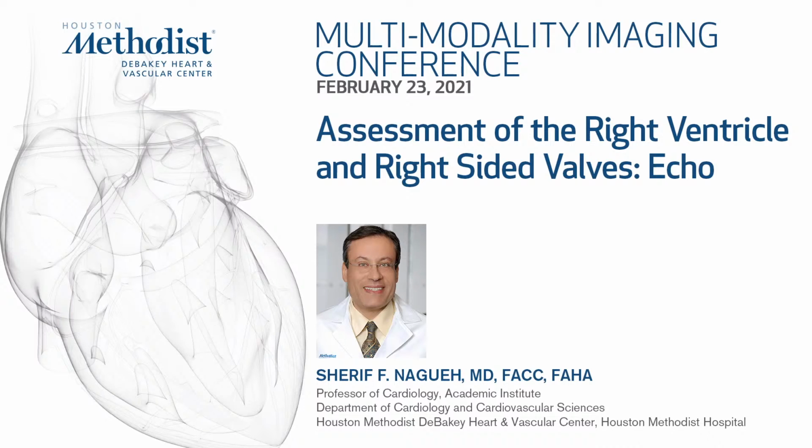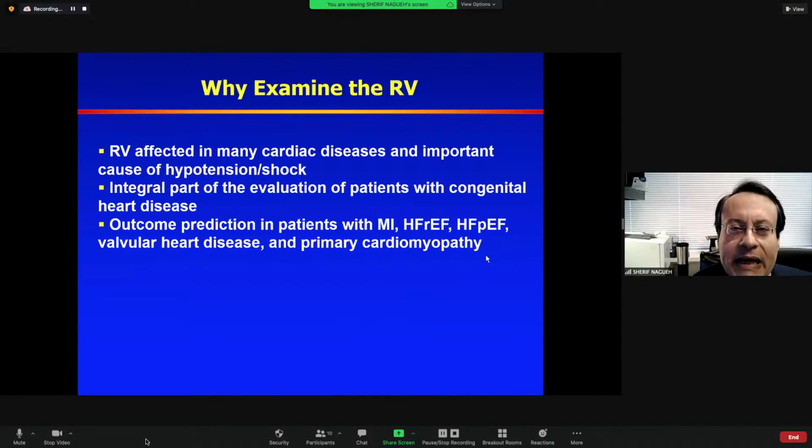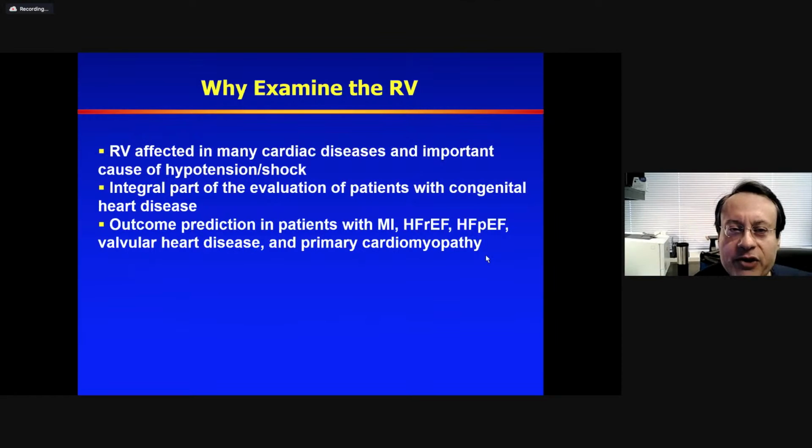Artery pressures and tricuspid regurgitation assessment. So why examine the RV? As you know, the right ventricle is affected in many cardiac diseases.